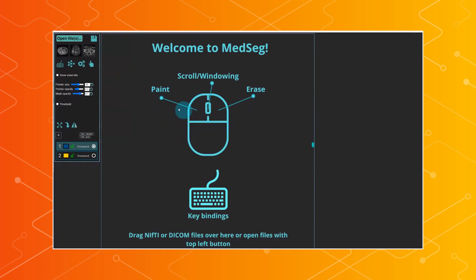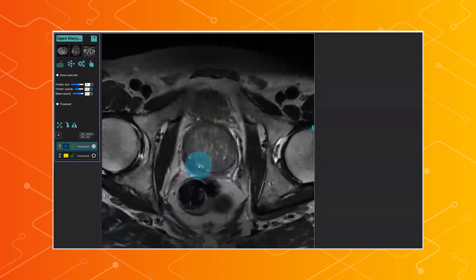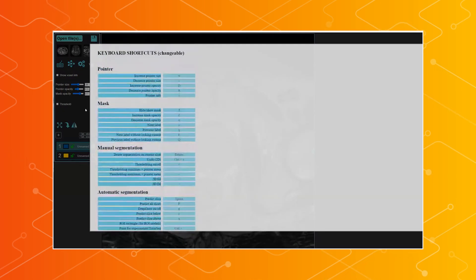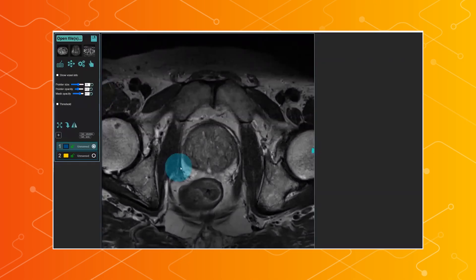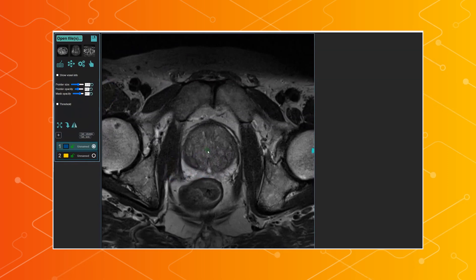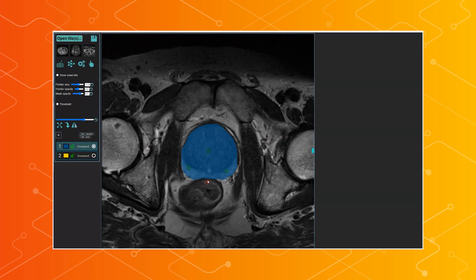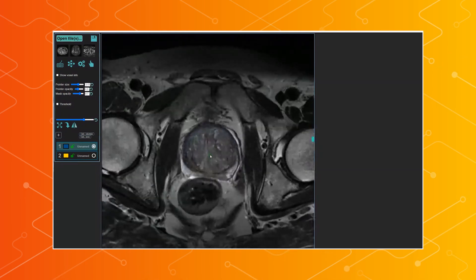Here you can drag data into the browser to open your own data, or you can just open one of the demo files. For example, this one, which is an MRI — Magnetic Resonance Imaging — of the prostate, which is this organ right here. Here are some key commands that can be used. A lot of it is key command-based. And here are the TensorFlow.js models. When I click this one, it loads the MRprostate model into the browser. Now I can place a point — the model is trained to take user input along with image data and produce this result. I can place more points to make it more correct, and I can place negative points to correct the segmentation. This can be done for all of the slices.